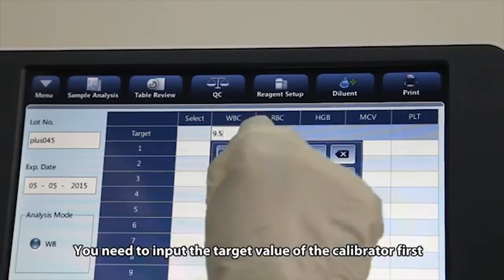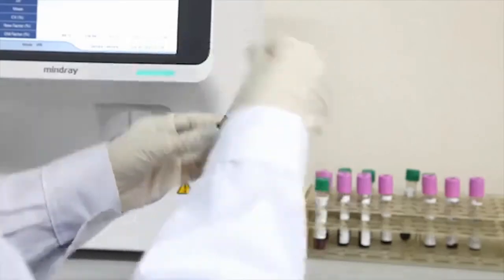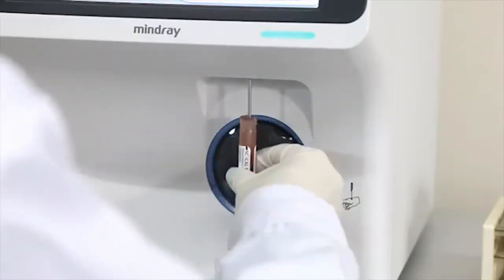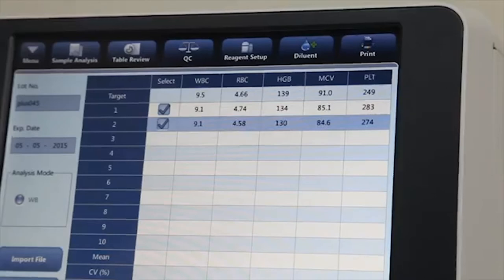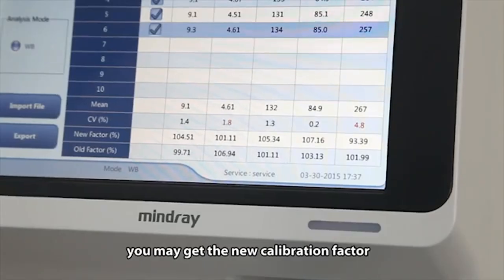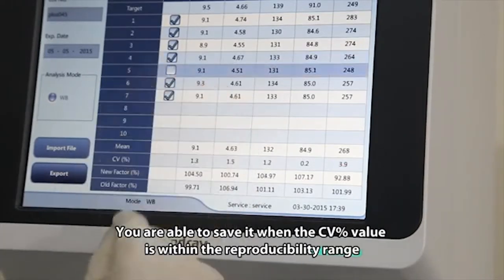You need to input the target value of the calibrator first. Then mix the calibrator tube well and run it through the sample probe. After running the calibrator 5 to 10 times, you may get the new calibration factor. You are able to save it when the CV percent value is within the reproducibility range.